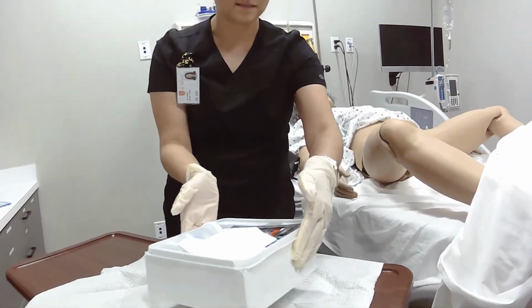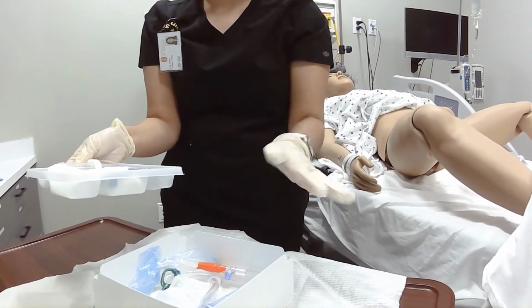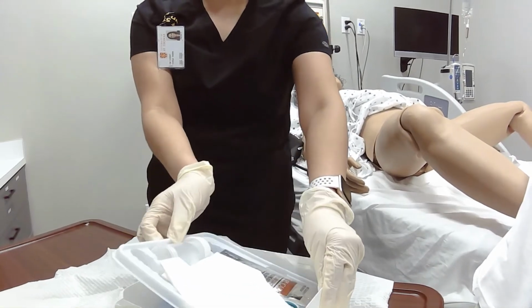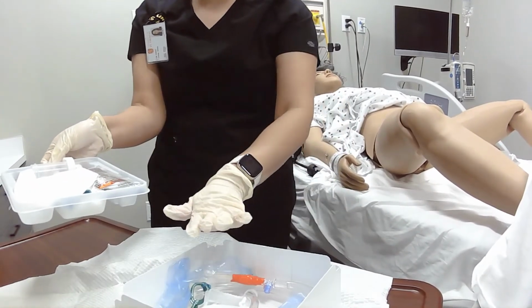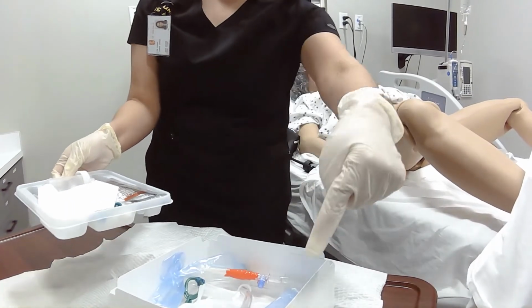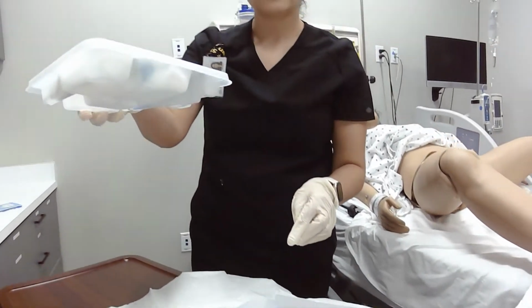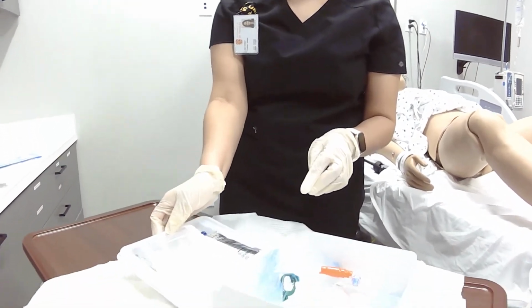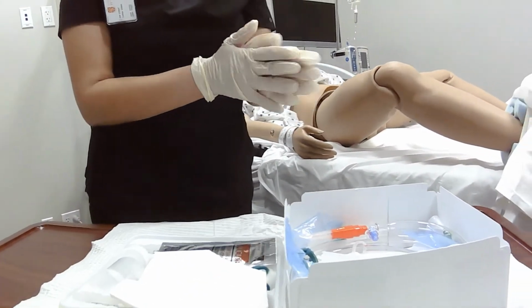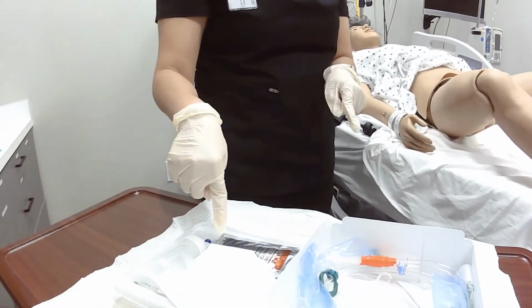So I'm going to rearrange a few things. So with this particular kit, you have 2 trays. You have the bottom tray and you have the top tray. So I'm gonna need to separate them both. So in order to do that, I'm just gonna shift the big box, the bottom tray, over, just making sure that I'm within the 1-inch margin. And then I'm gonna set the top tray right next to it, again, making sure that I'm within the 1-inch margin.